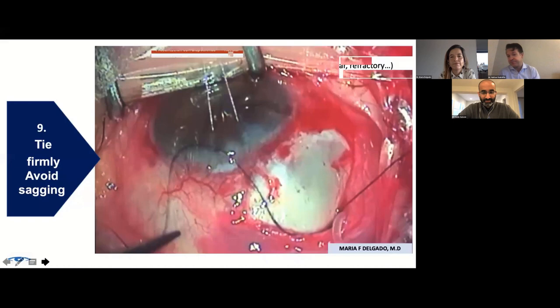I think this is a really important point because you'll hear a lot of fear as to how far back you can go from the limbus. If you're supratemporal, the package insert says 8 to 10 millimeters. The reason for that is if you go further than 10 millimeters, in some cases, the plate can actually touch the optic nerve. And there's been some research on that from Ramesh Ayala and others showing that that can actually impinge on the nerve and cause some damage in itself.